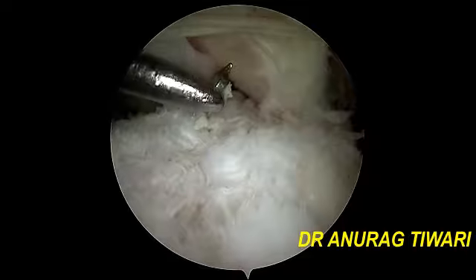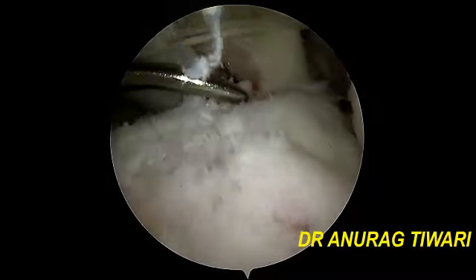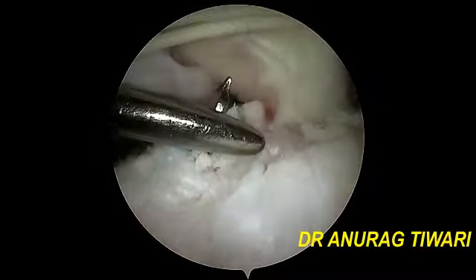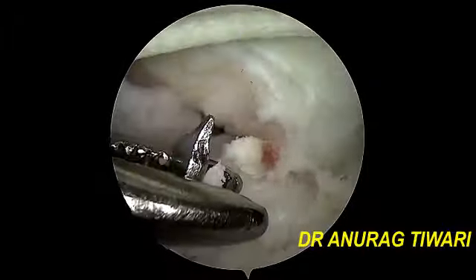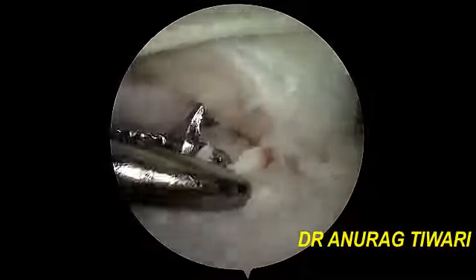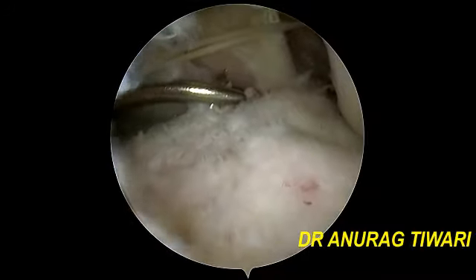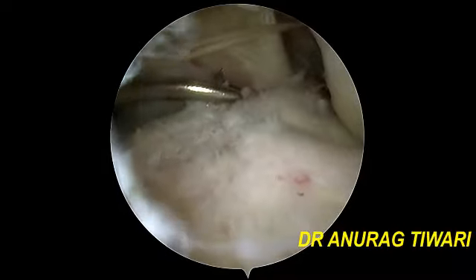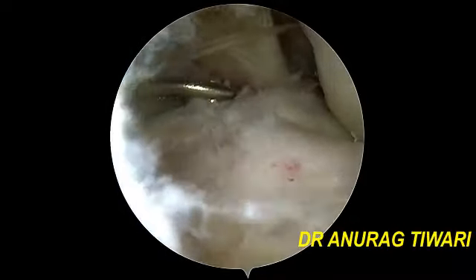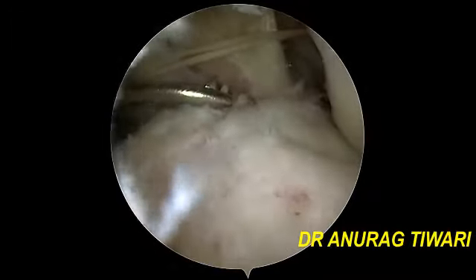You remove the jig and you fix this guide wire with the help of artery forceps, and you drill the tibial tunnel with an adequate size reamer. In this case it is a 9 mm graft, so I will use the 9 mm tibial reamer. The tibial reamer is a non-flower tip, whereas the femoral reamer is a flower tip. So that is a way to differentiate between these two.